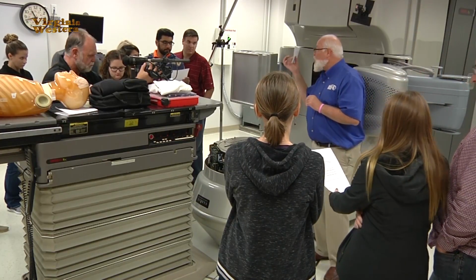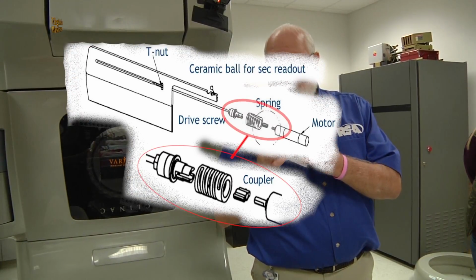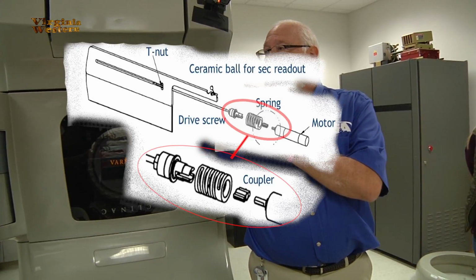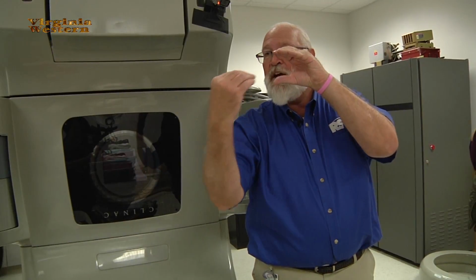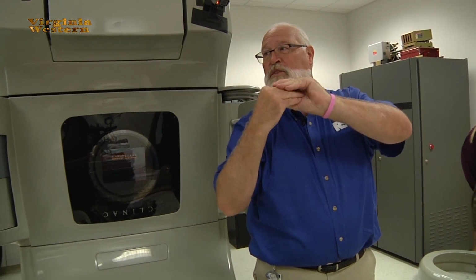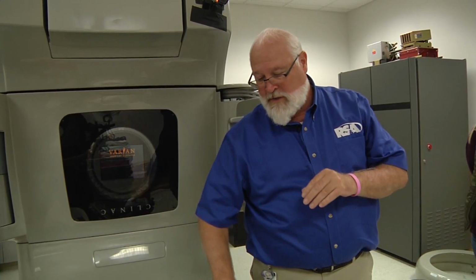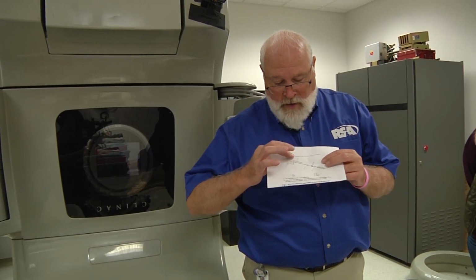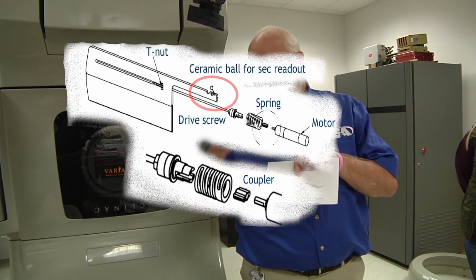and we're going to have a little coupler. So the coupler is what's attached to the motor and mates to the drive screw. So you've got a little channel, and you put that in there, so that's what's grabbing the drive screw to turn. It's that coupler. So that's the makeup of the system. On top of this is a little ball spring.